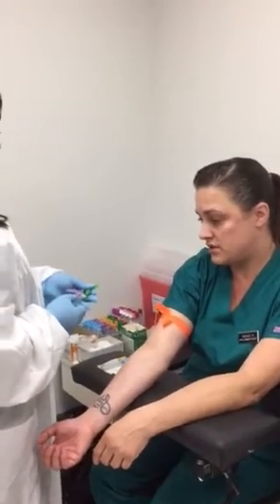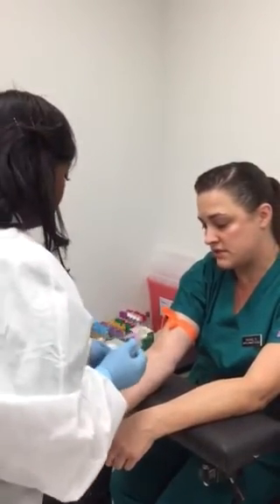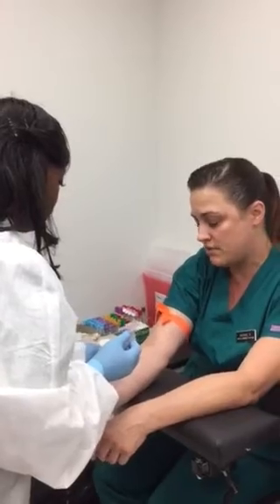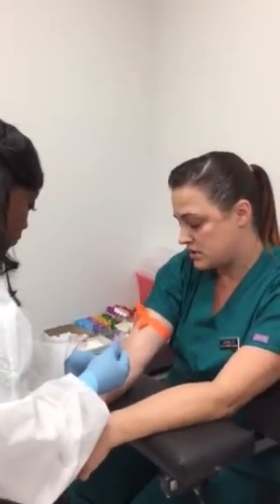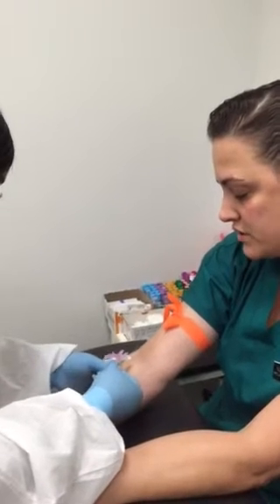She's going to unengage the safety and check the bevel of the needle to make sure that there are no spurs in it. Make sure that it's beveled up. She's anchoring the vein and she's going to enter in at a 30 degree angle.